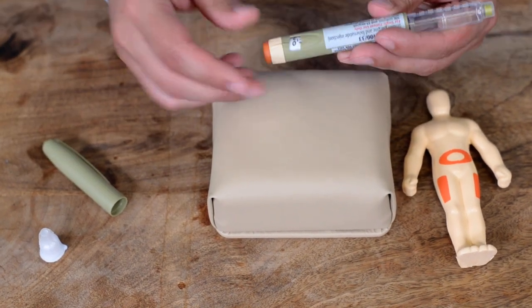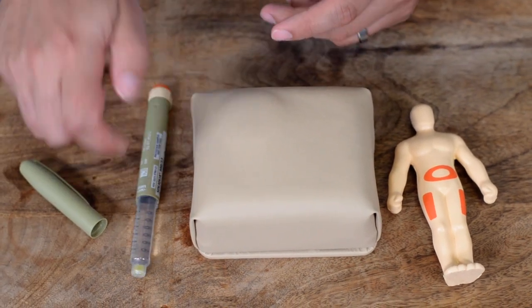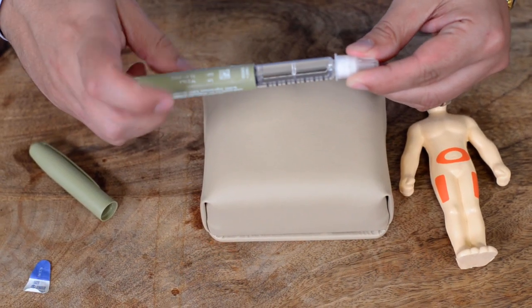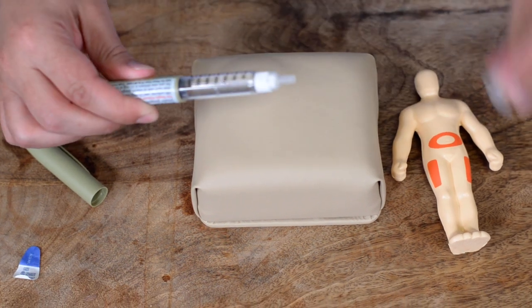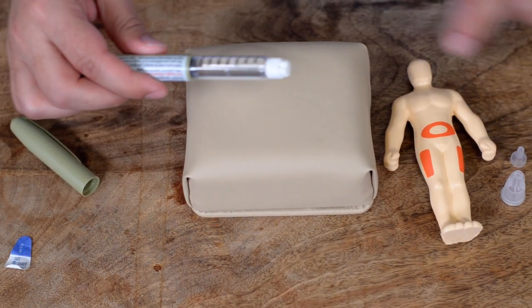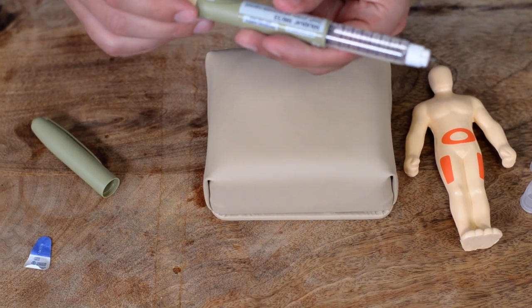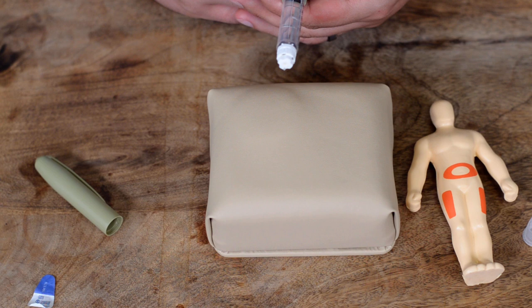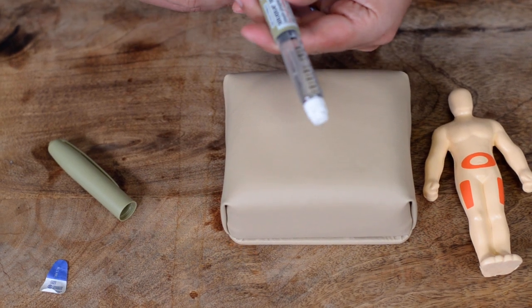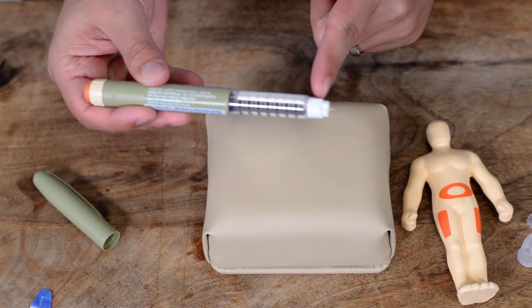The first time you use a pen — and this is true for any insulin pen — you need to prime it. First, put on a needle: remove the seal, attach the needle, and screw it on. Then remove the outer cap and the inner cap. You will see a very tiny needle. We recommend priming with at least two units to start. Push until you see a little drop coming out; if you don't, do another two units until you see a real drop.